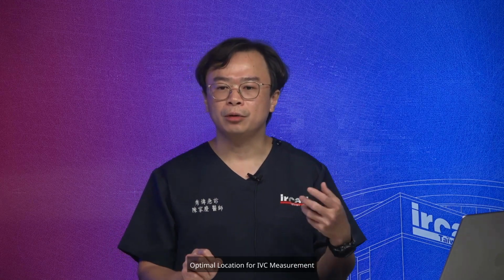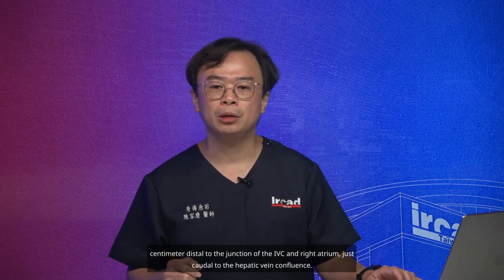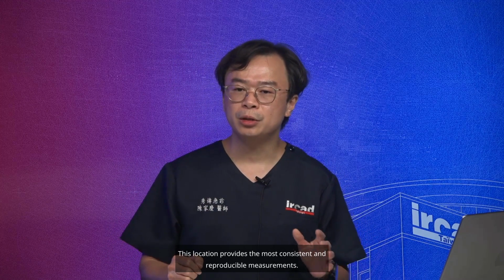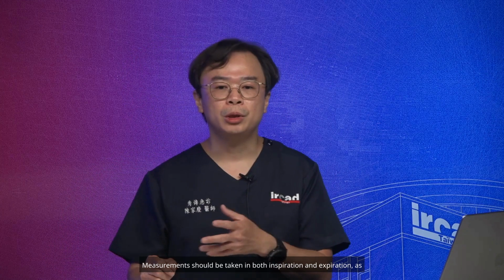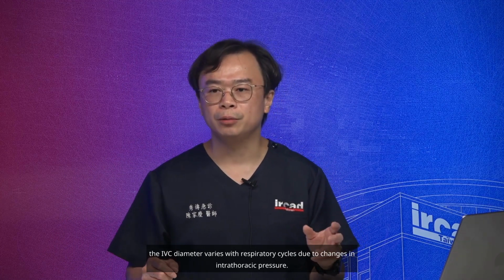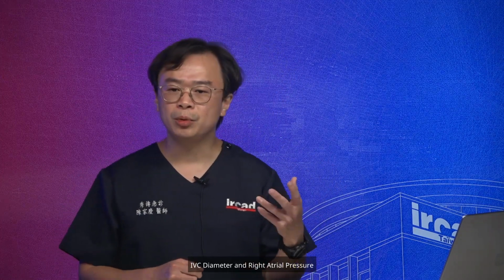Optimal location for IVC measurement. The standard location for IVC measurement is approximately 2 to 3 cm distal to the junction of the IVC and right atrium, just caudal to the hepatic vein confluence. This location provides the most consistent and reproducible measurements. Measurements should be taken in both inspiration and expiration, as the IVC diameter varies with respiratory cycles due to changes in intrathoracic pressure. Some experts recommend averaging 3 measurements for greater accuracy: IVC diameter and right atrial pressure.